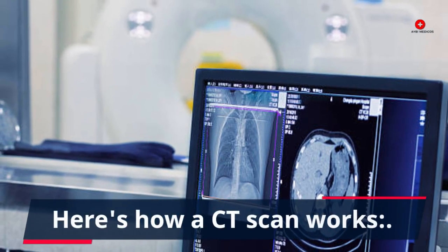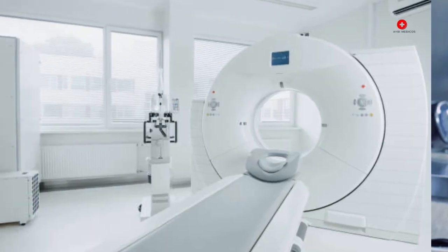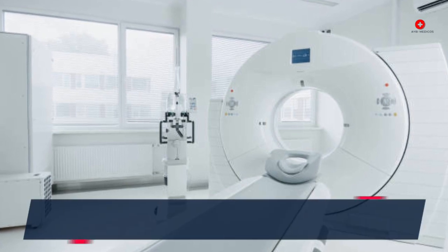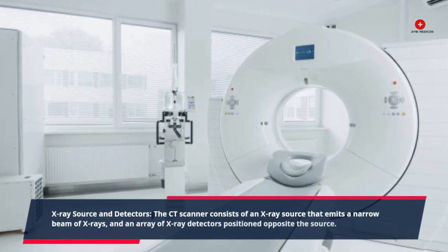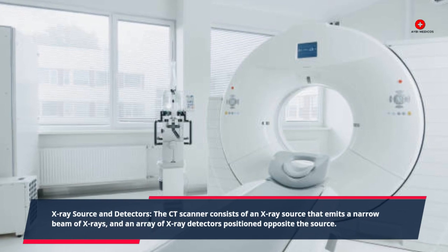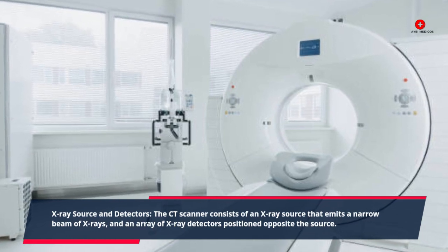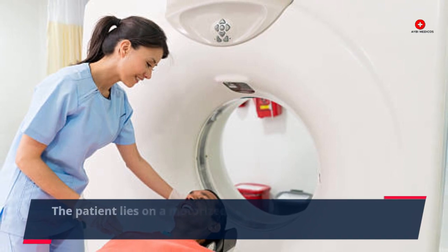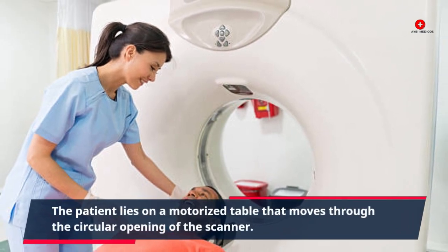Here's how a CT scan works. The CT scanner consists of an x-ray source that emits a narrow beam of x-rays and an array of x-ray detectors positioned opposite the source. The patient lies on a motorized table that moves through the circular opening of the scanner.